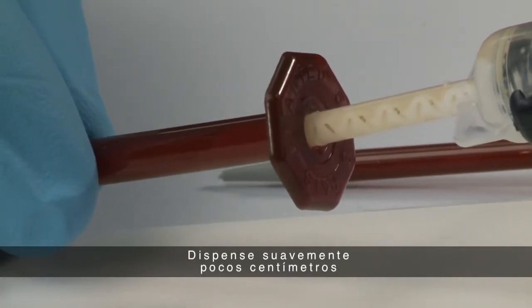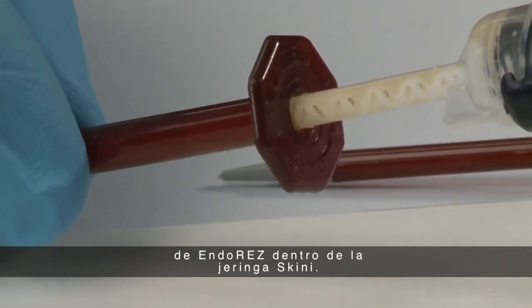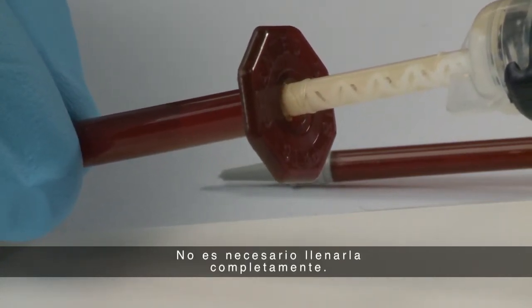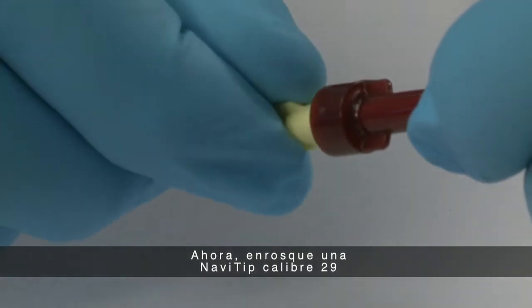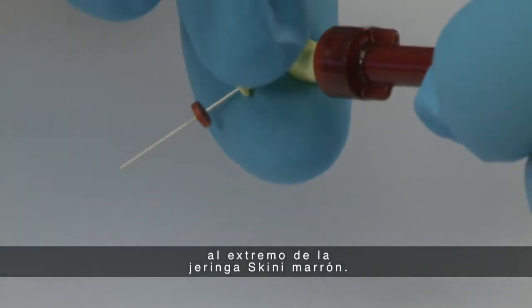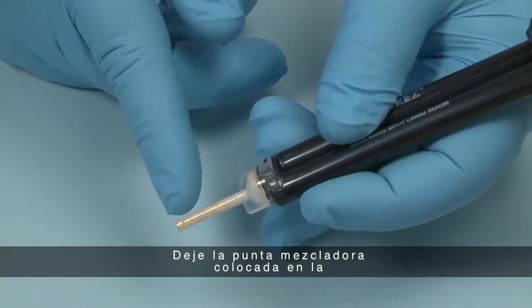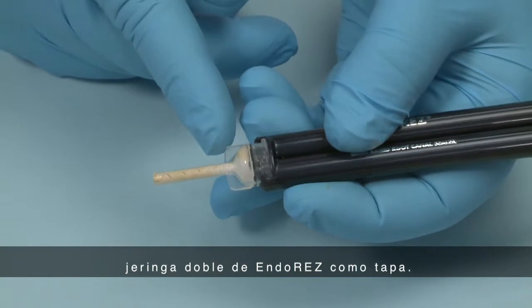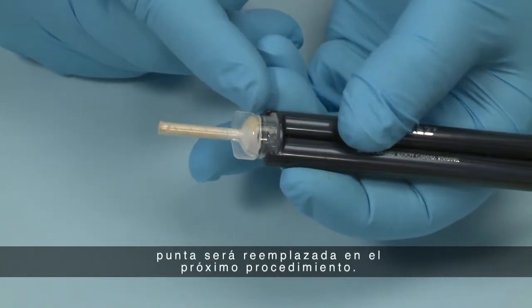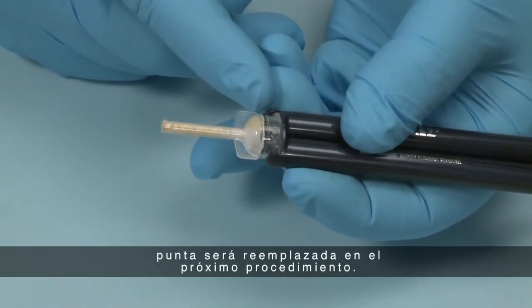Gently express a few centimeters of EndoREZ into the skinny syringe. It is not necessary to completely fill the syringe. Next, attach a 29-gauge Navi tip to the end of the brown skinny syringe. Leave the mixing tip on the dual barrel syringe of EndoREZ as a storage cap. The chemical will set in it, but the tip will be replaced during the next procedure.